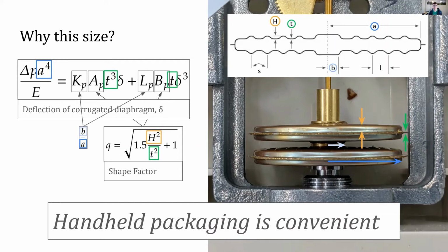Stacking more capsules saves space because A can be smaller. A can only be so small because B has to be big enough to let air through the membranes, and B over A needs to be small. It's easier to have two capsules. The number of corrugations changes the properties subtly, but those effects are minimal.